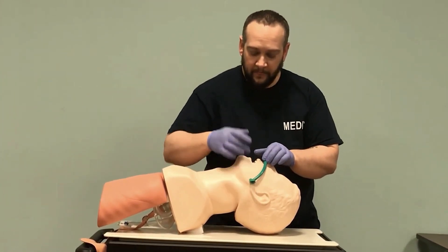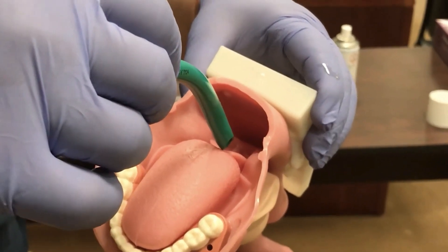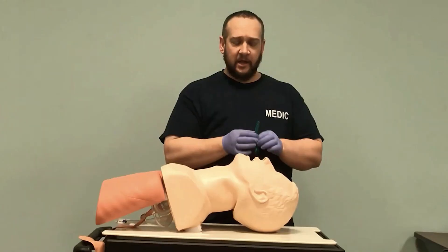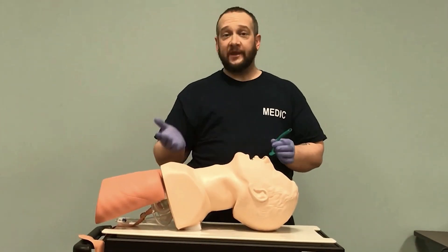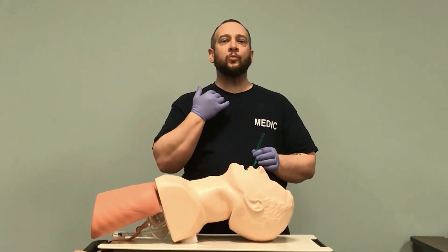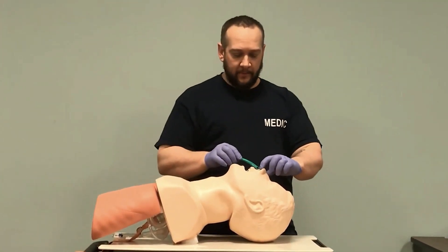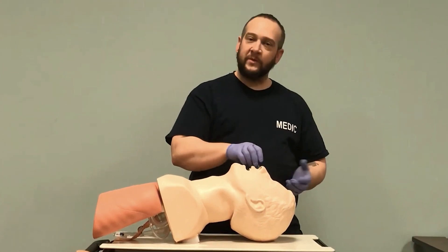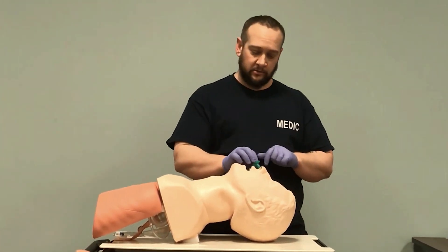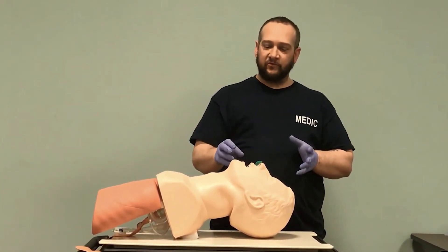When we measure, we're looking at where this is going to sit to help hold that tongue. It's not as secure as an OPA because the OPA is rigid plastic, but it does better than nothing. If someone is semi-conscious, it sits in the back of the throat and helps prevent the tongue from falling back. If you meet resistance, take it out and go in the other naris. Once seated, that flange allows you to ventilate right through it.